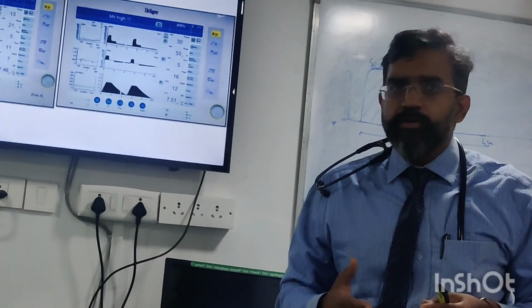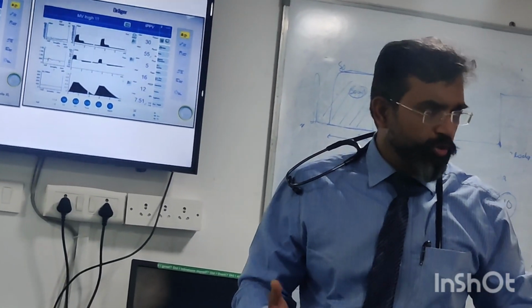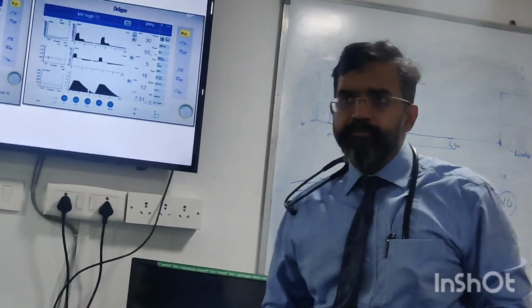So when you are nebulizing a patient, what is happening to my peak pressure? What is happening to my flow? What is happening to my peak expiratory flow? You are supposed to see that. And what is happening to my patient? Clear? Right?